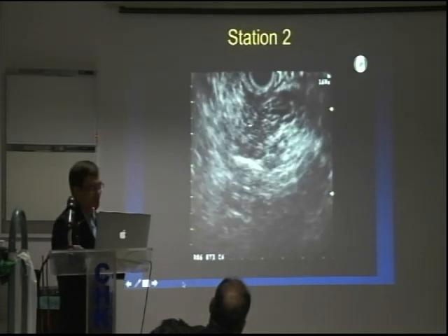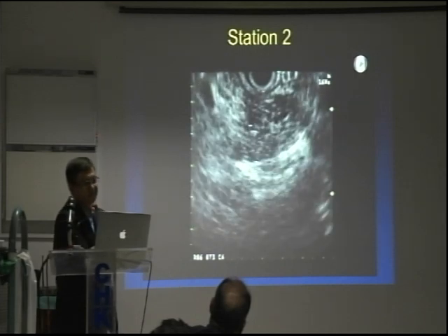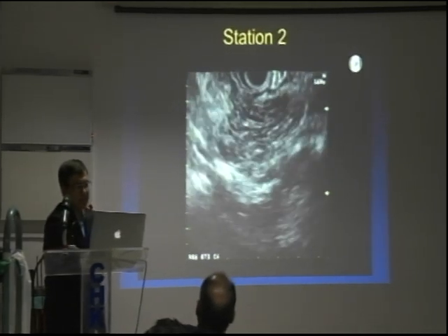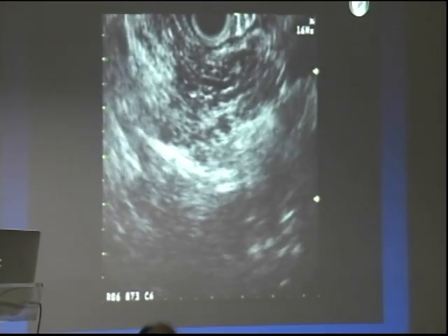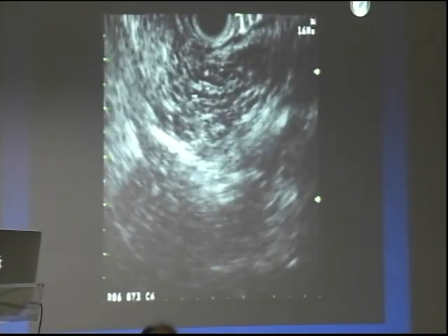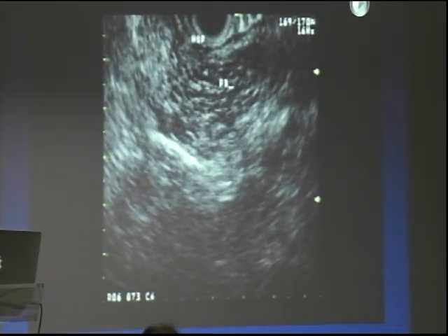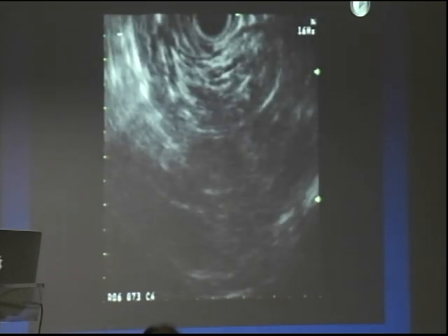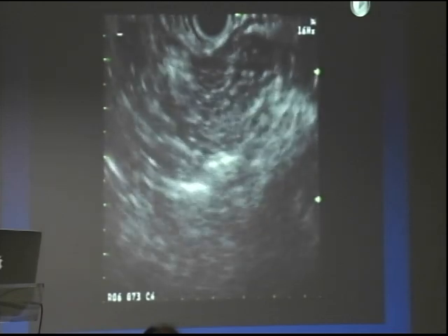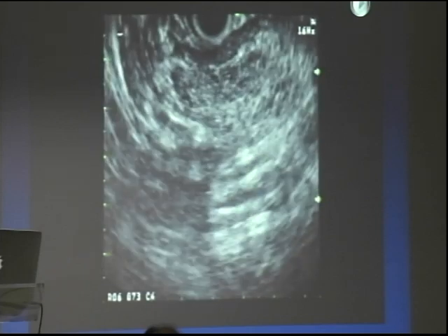Pancreatic duct clearly in view. Clockwise and counterclockwise torque is applied to fully interrogate this area. If one needs to specifically see the ampulla, one can administer glucagon and instill water into the duodenum in order to more fully interrogate the ampullary area. With forward and backward movement, as well as torque, the pancreatic head can be interrogated from the ampulla of Vater.